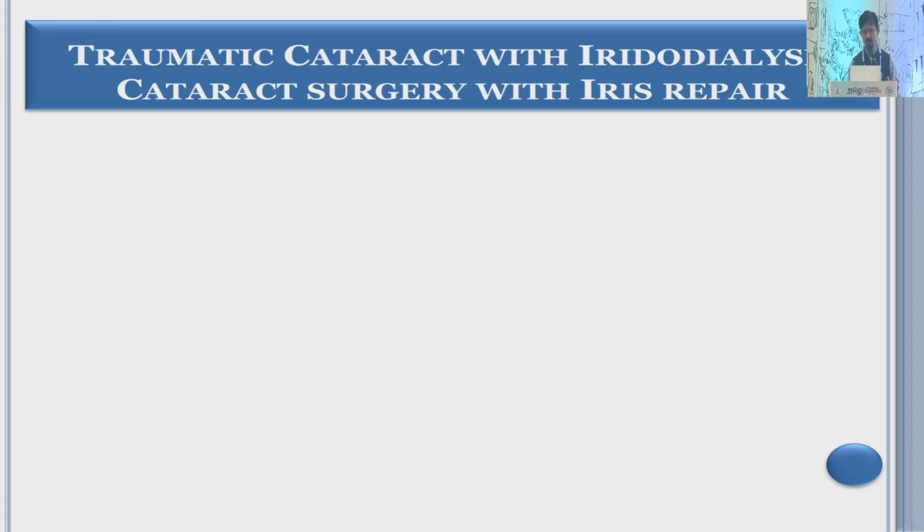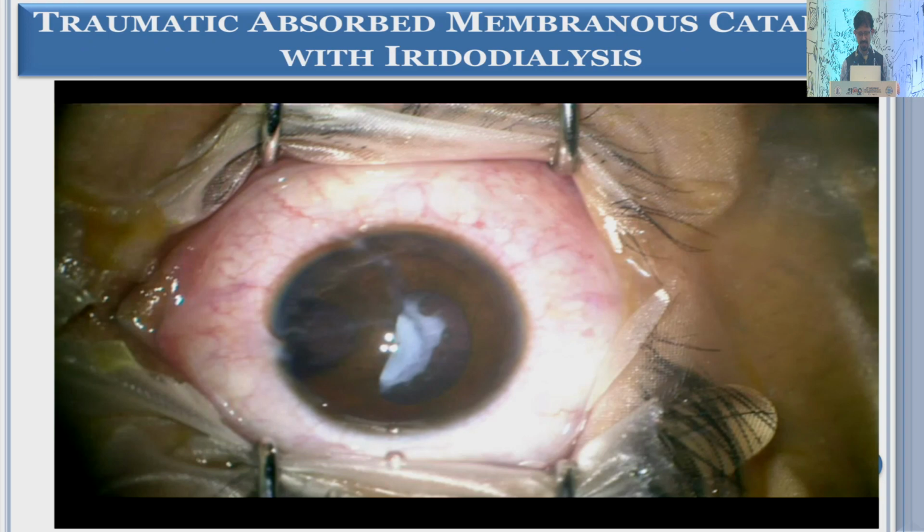Dr. Namta will come and talk about cataract surgery in eyes with corneal opacity and disorders. I'll be talking about traumatic cataract with iridodialysis, and we'll be doing cataract surgery. We'll be showing cataract surgery with iris repair.